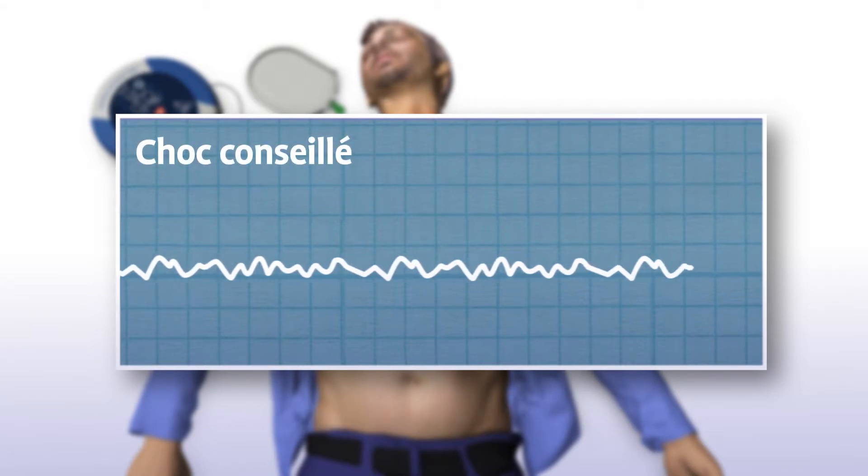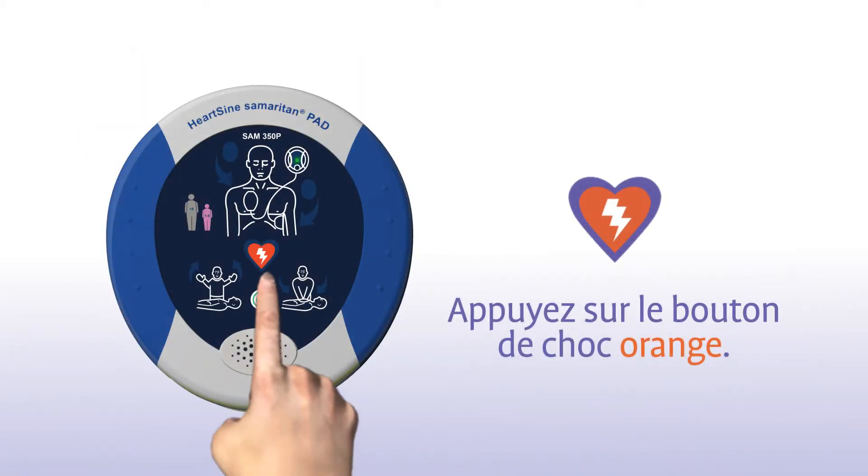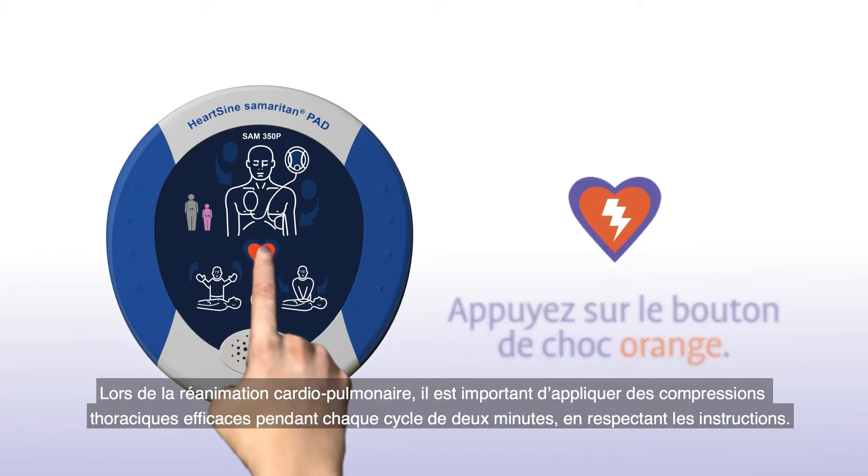Shock recommended. Stand clear of the patient. Press the orange shock button. Shock delivered.